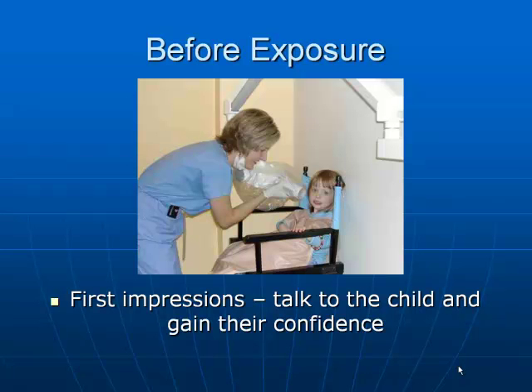Obtaining quality radiographs on children can be challenging. Before exposure, the radiographer needs to make a good first impression by talking to the child and gaining their confidence. The radiographer needs to establish rapport with the child by explaining the procedure so the child understands what is expected.